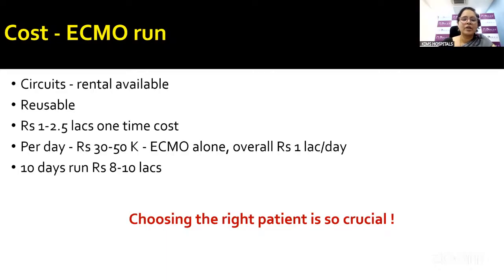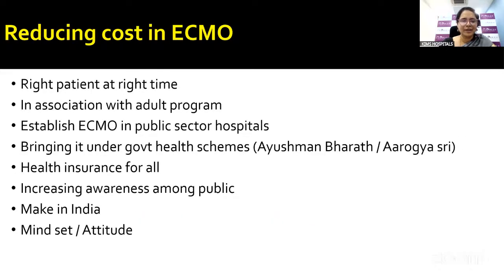And the working or running cost on a daily basis can be anything between 30 to 50,000 a day to as much as 80,000 to 1 lakh, based on the number of investigations and the other antibiotics and disposables that the child is requiring. So choosing the right patient or choosing the right time for initiating ECMO can be crucial.